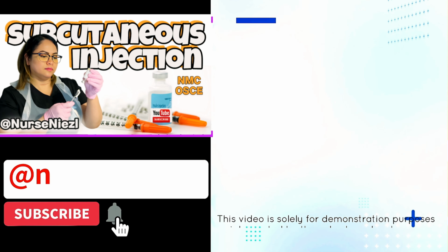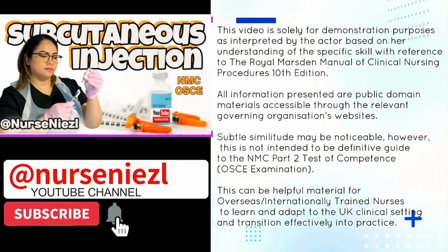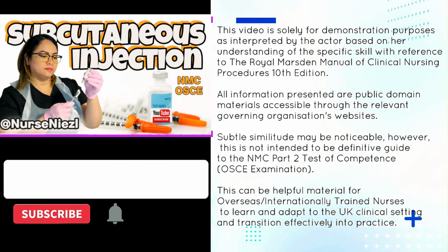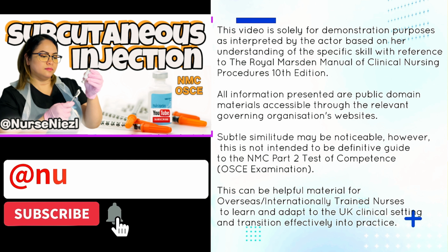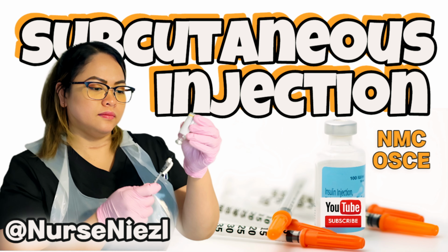This video is solely for demonstration purposes as interpreted by the actor based on her understanding of the specific skill, with reference to the Royal Marsden Manual of Clinical Nursing Procedures, 10th edition. All information presented are public domain materials accessible through the relevant governing organization's websites. Subtle similitude may be noticeable, however, this is not intended to be a definitive guide to the NMC Part 2 Test of Competence or the OSCE examination. This can be helpful material for overseas or internationally trained nurses to learn and adapt to the UK clinical settings and transition effectively into practice.